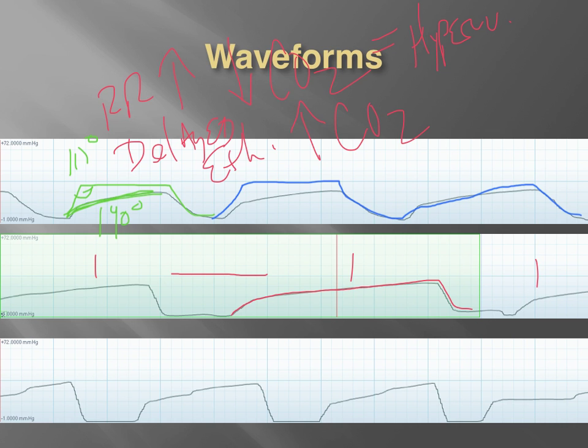So this patient's a little bit unique in that there was also that, remember, allergic reaction. Well, what happens in allergic reactions? We pretty much have a distributive shock developing in this patient. So she has an increase in respiratory rate. Her waveform is sloping, but it's not terrible. So we may not have too much gas restricted from exhalation as far as carbon dioxide goes. But we may also have a perfusion issue. Okay, so remember, we're thinking ventilation, perfusion, and metabolism.